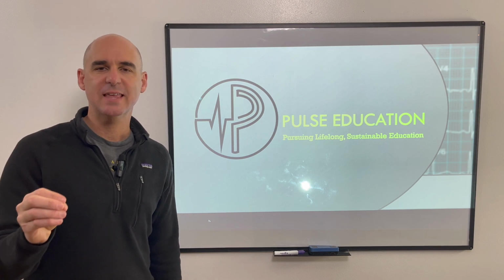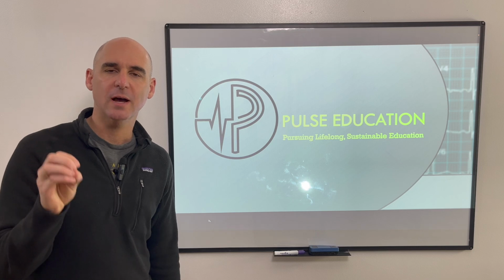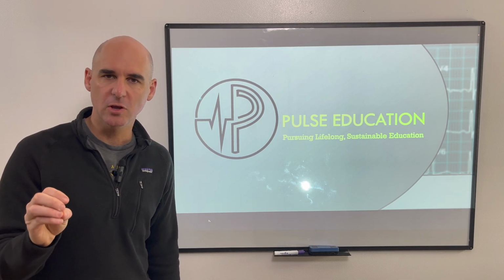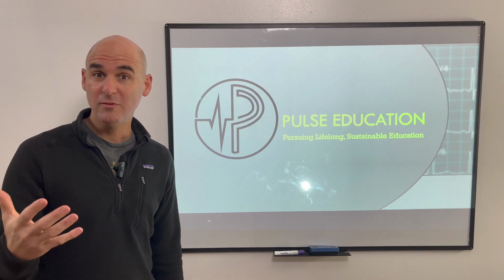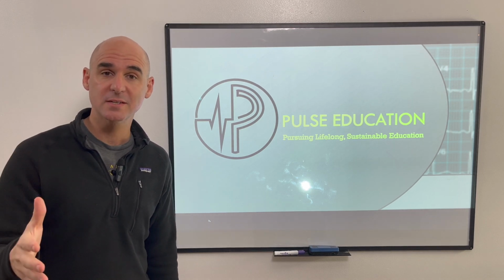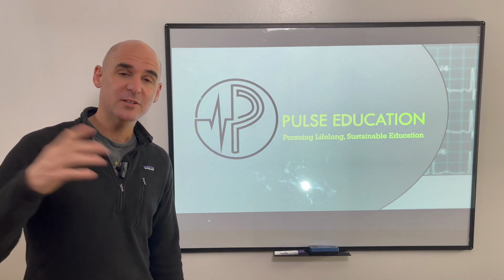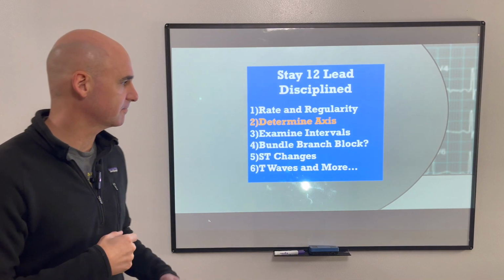And the thing is that I promise you, if you know how to use axis and how to apply that to interpreting a 12-lead, it will pay dividends for you, especially when you have more complex cases or you have 12 leads that when you see them, there's a lot of things going on with them. It is going to help you tremendously in properly interpreting your 12 leads. So that being said, this video is on right axis determination. Thanks for joining us. Let's get into it.